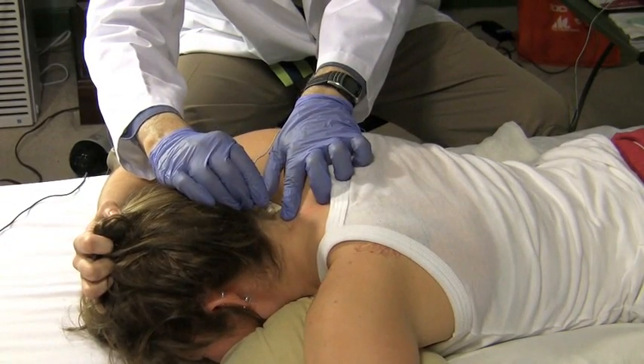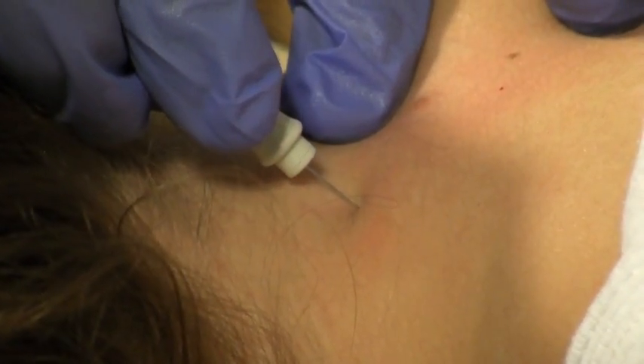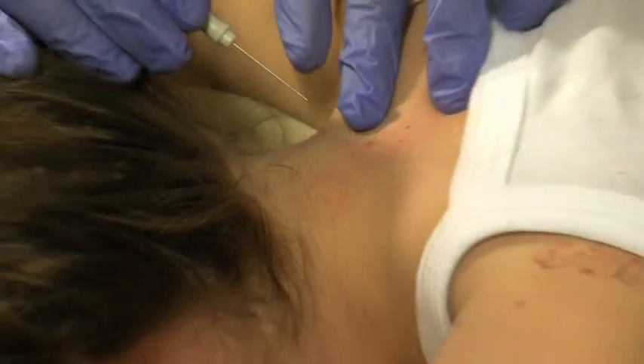And then I do C6 here, one level above. Perfectly normal insertion activity. And I take the needle out. Thank you. Bye-bye.